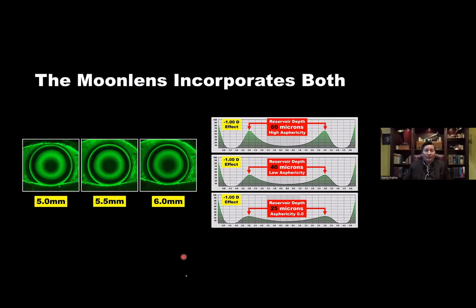As an example, if you were fitting an adult in Ortho-K, and the research suggests that about 15% of the patients we fit are adults in orthokeratology, we don't want them to have a tiny treatment zone. They're going to have aberrations. They're going to have flare and glare.